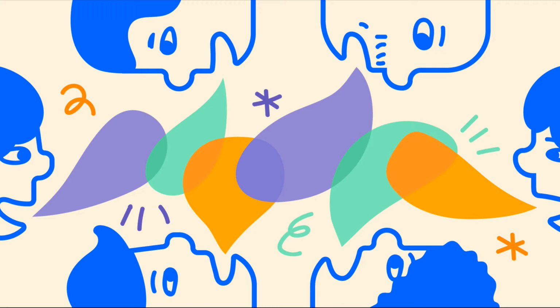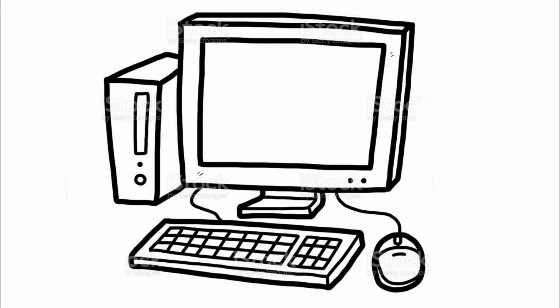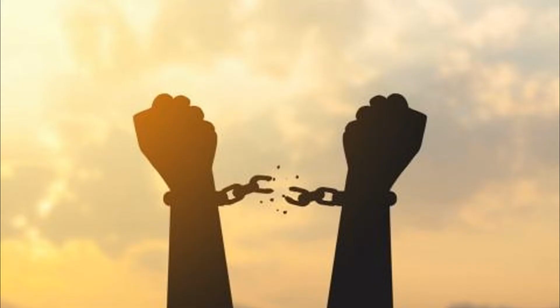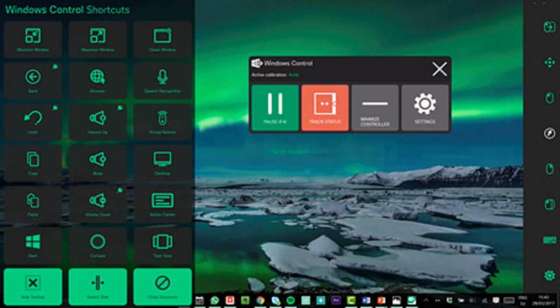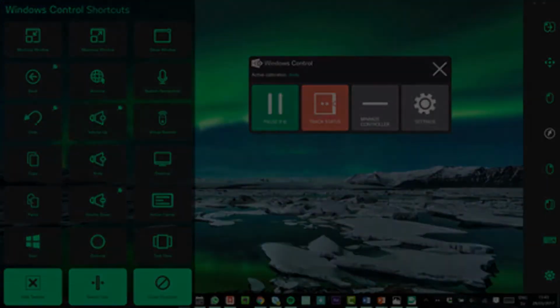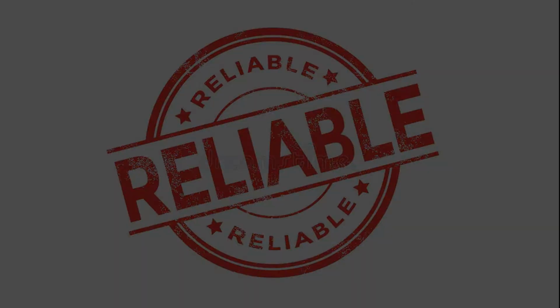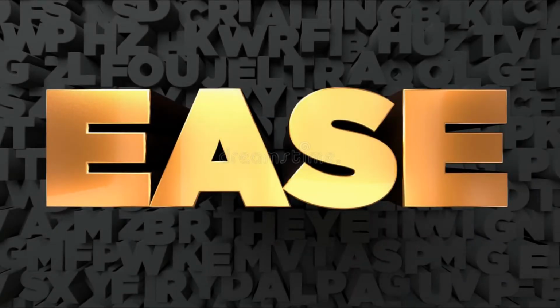Being that I use my Tobii like a regular computer, I don't need others to set up or maintain my device. I have the freedom to customize my device. Using Nextup Talker to speak, and Windows Control to control my Tobii, I've found everything to be more reliable, not dropping emails, text, or just the ease of running programs.